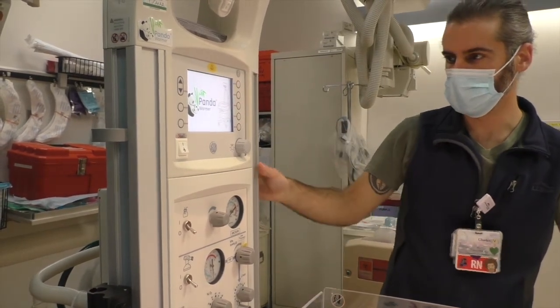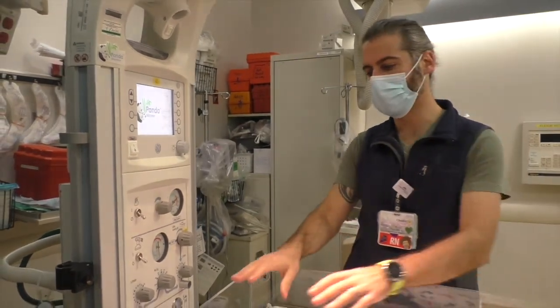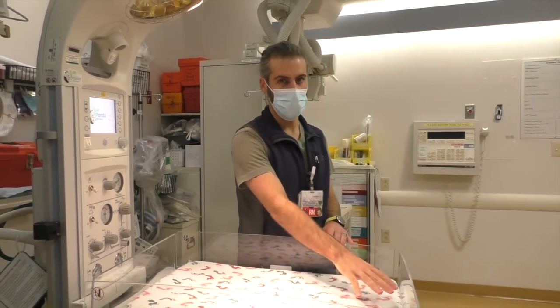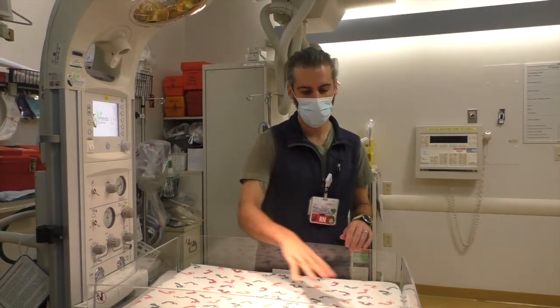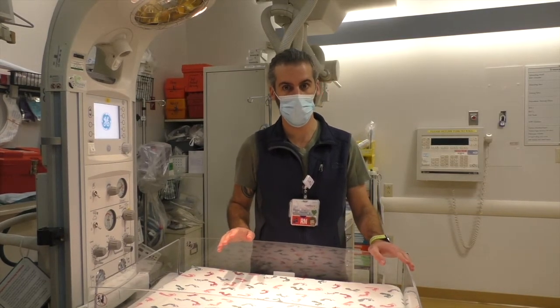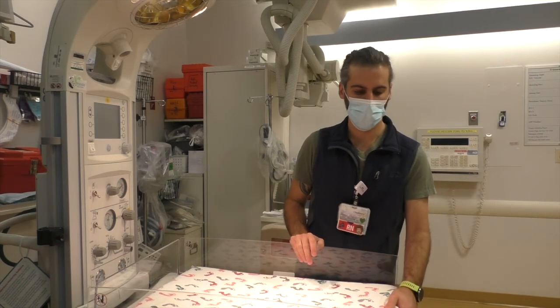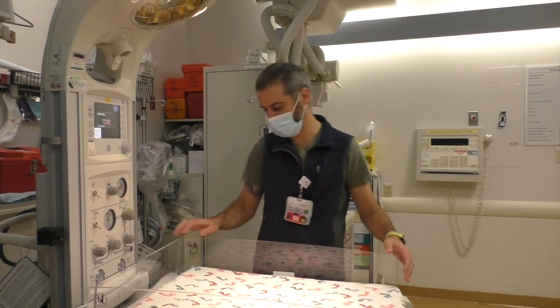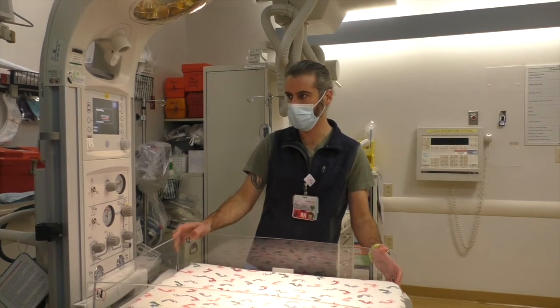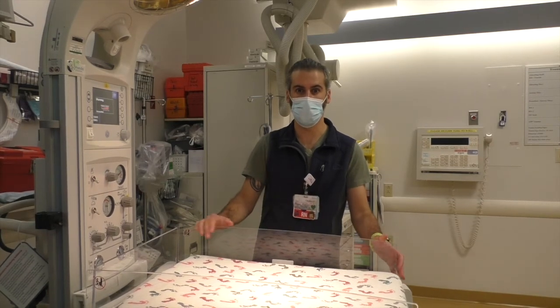The other functions that are great about this is when they come in intuitively with an adult, you put the head of the bed next to the airway wall, but with this, we actually want to place the head of the infant away from the monitor. That way, if you need to do any procedures, or if the baby starts to code or needs a definitive airway, you can actually lift up and lower the side rail so that you can get directly to the head. And then there's a footboard on the bottom that can raise and lower the panda warmer so that it's more ergonomic for the rest of the staff.